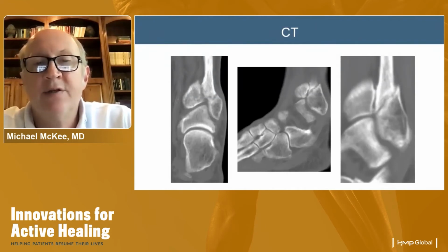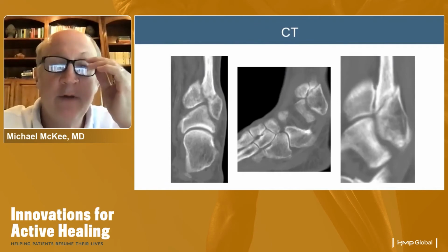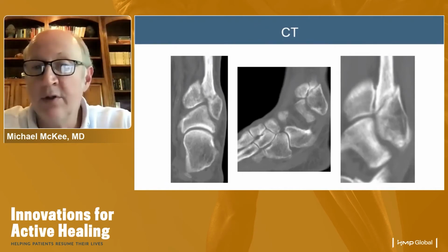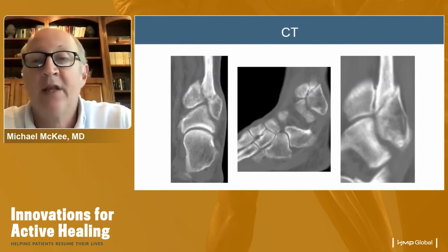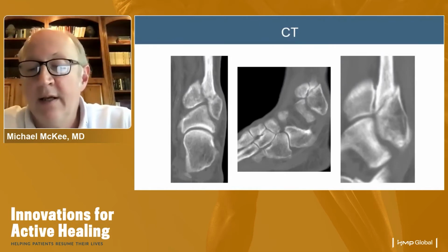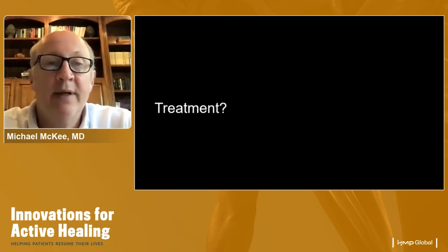So I think that this probably represents two options here. One is to fix it, which I think might be the conventional option. And the other is if you've got a stable ankle fracture, the mortise is not moved and looks good. There's obviously no infection here. And if it healed like this, I think everyone would be happy, no bad deformity. This represents an opportunity for a LIPUS to make things better.